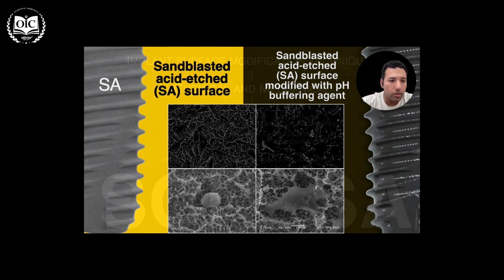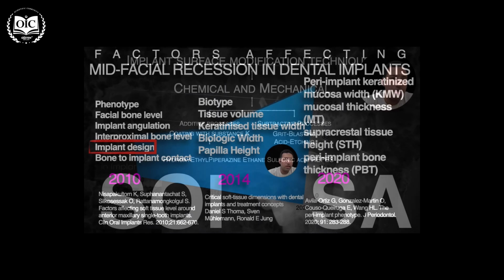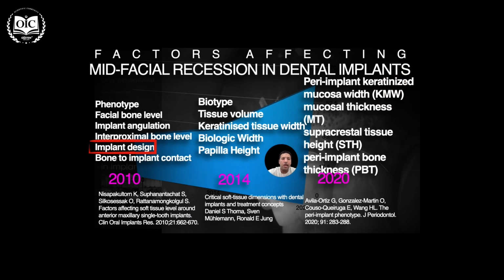So we have the SOI now, the super osseointegration surface, that is maybe faster in osseointegration than the regular surface of the TS3.